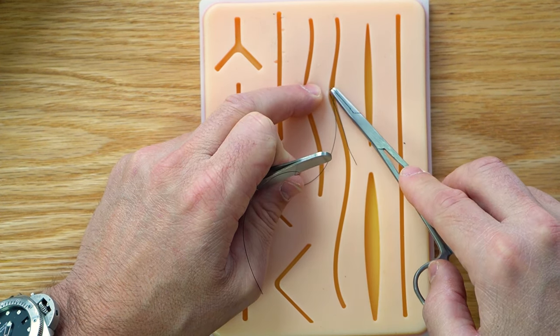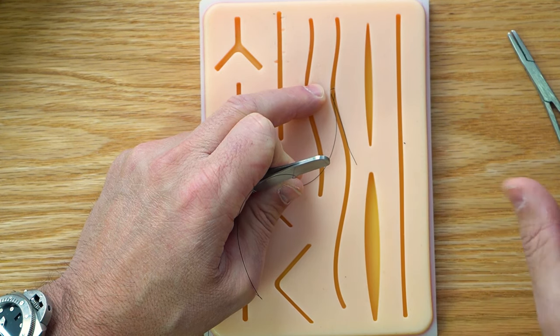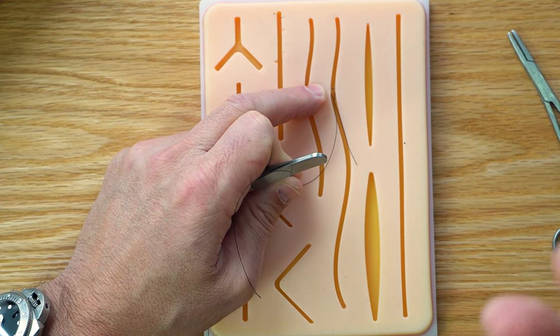I could probably even get closer to the skin, but as long as I have it in the dermis, I know that dermis is going to come together. Honestly, a lot of times the epidermis is not perfectly together, but I can squeeze it together with my fingers as long as the dermis is together, because I know the dermis is the strong layer. The epidermis is not, and the fat layer is not either, right? So the dermis comes together, and then I can take the skin affix, the glue, and glue the epidermis together. You can do that as long as you have the dermis, which is a strong layer, together nicely here.